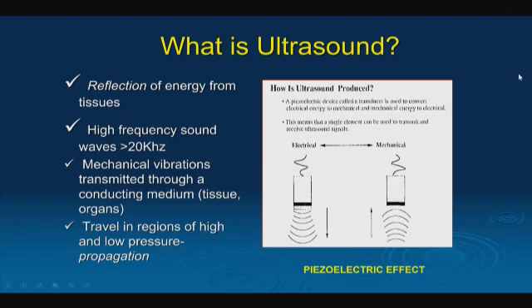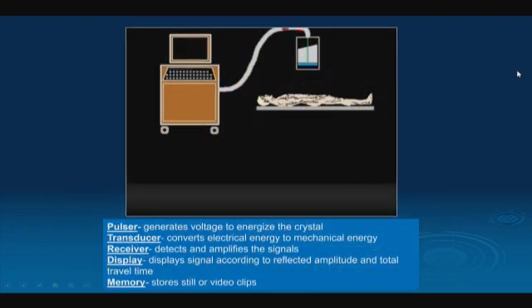Whether we're doing Doppler, spectral Doppler, color Doppler, imaging, or M mode, it's all sound waves and they're all generated in the same manner.